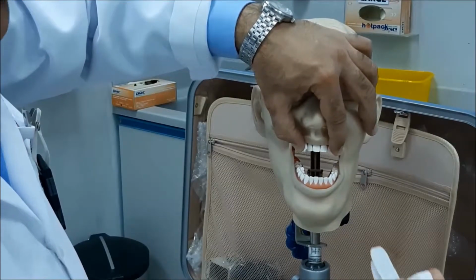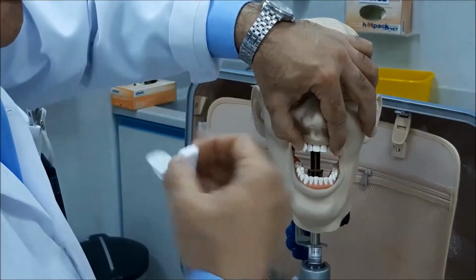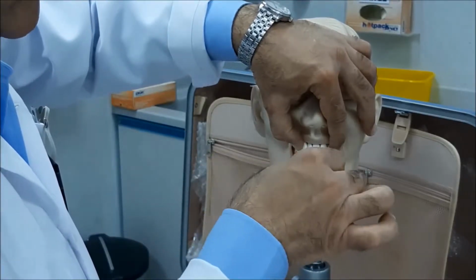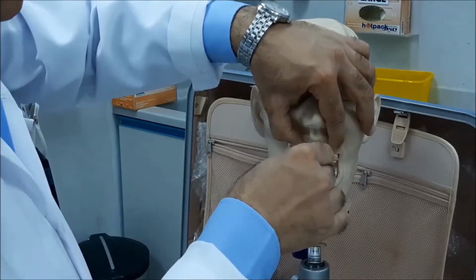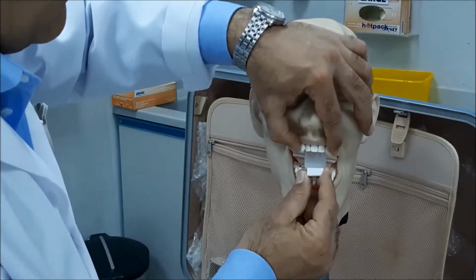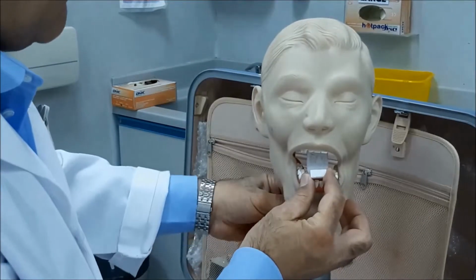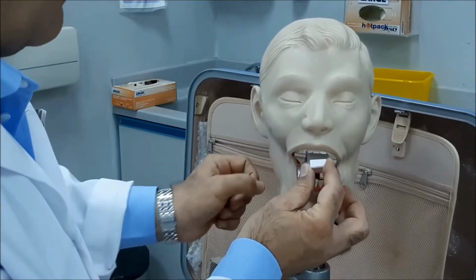You're going to ask the patient to open, examine the area, and then, just like we did with the previous sensor holders, you're going to turn it down, utilize the space inside the oral cavity, extend it all the way back, and then once you're satisfied, you ask the patient to bite on the block. Okay.